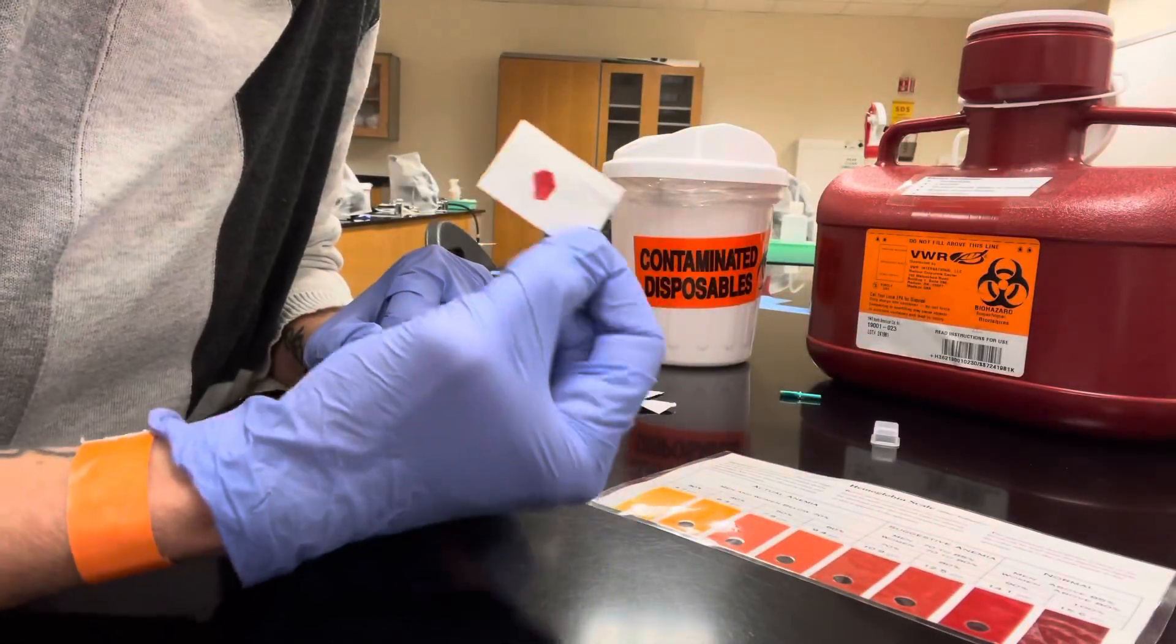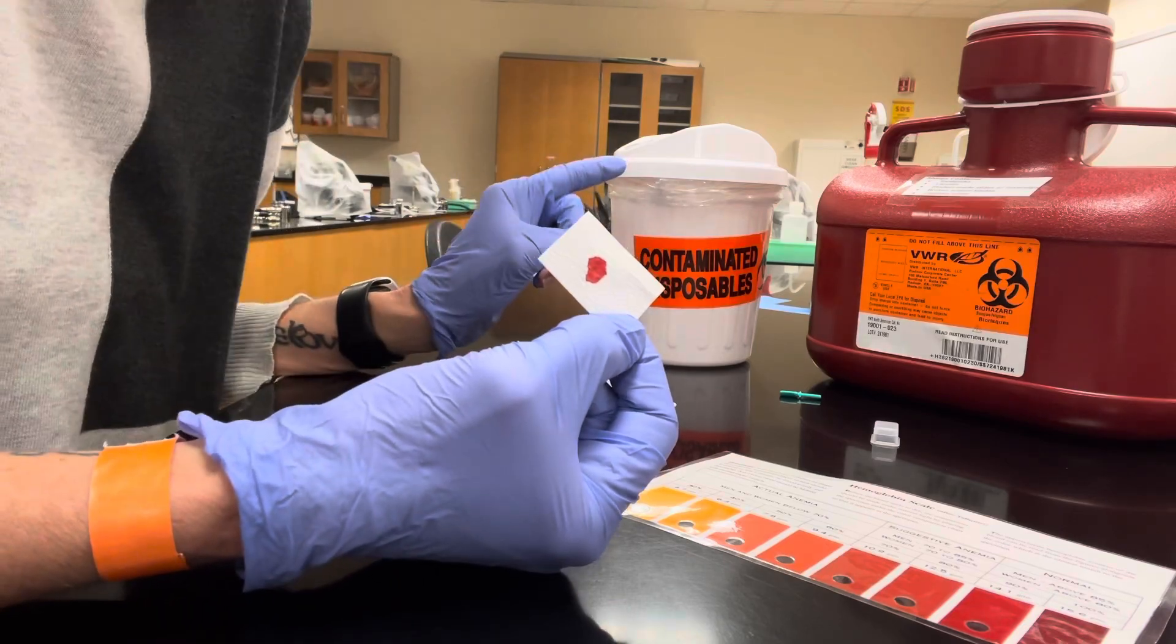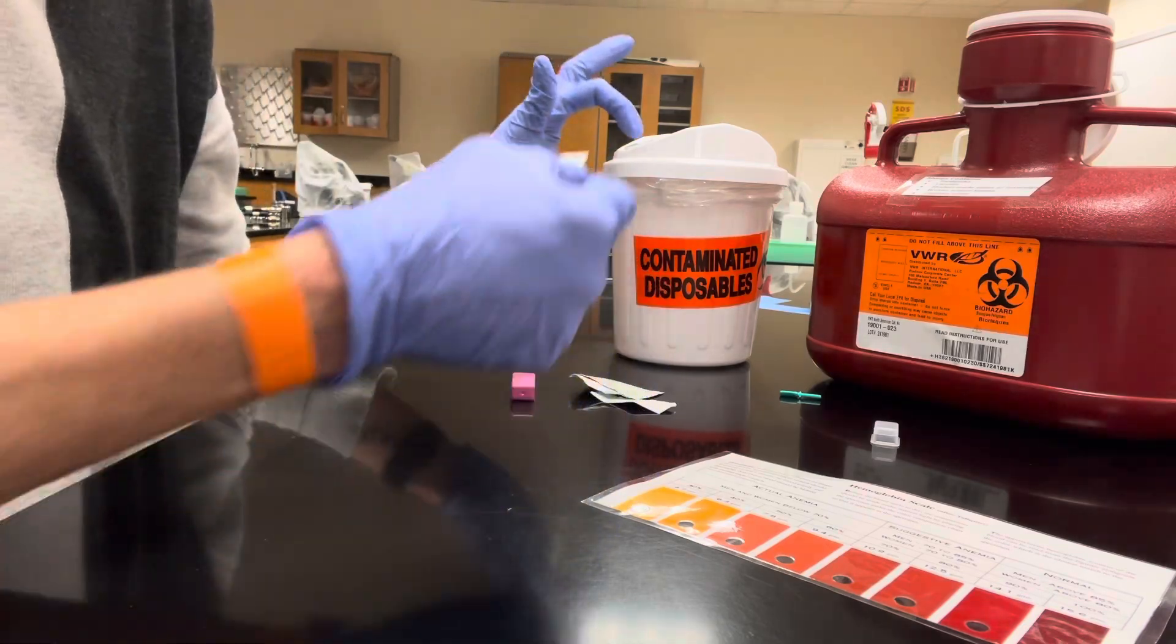Once you have done this, your Talqvist paper is going to be discarded into the biohazard can.